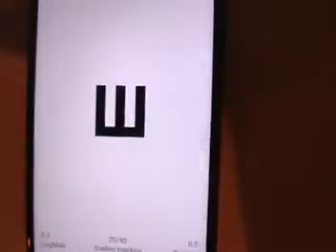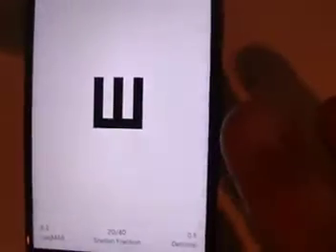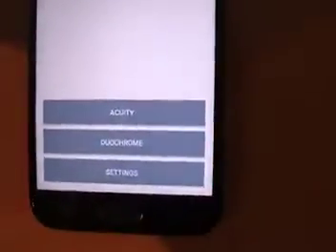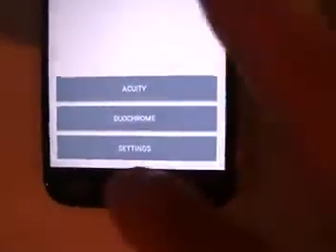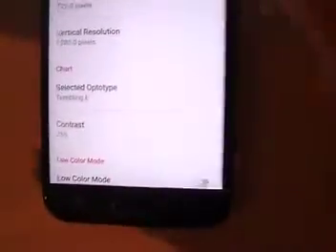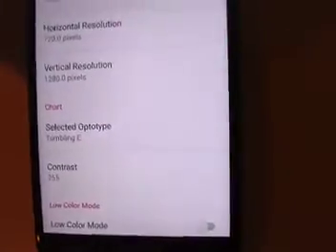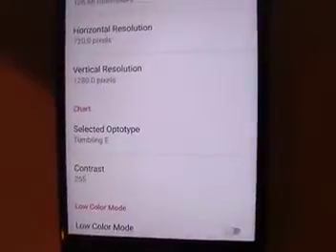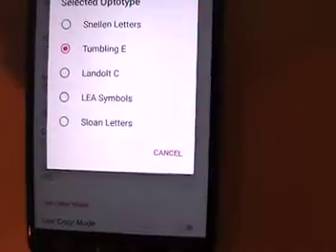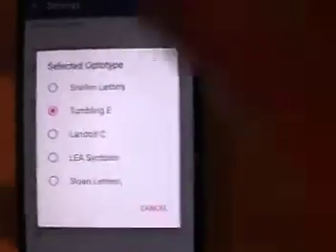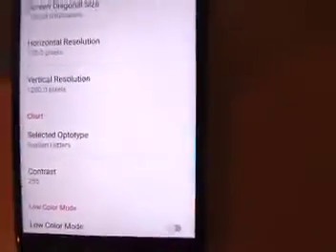Back to Out of it. Change the settings. You go to hit Settings and you get Tumbling E selected. Now you change to Optotype which is the conventional by hitting Snellen Letters. And that's loaded. And you go back and hit Acuity.